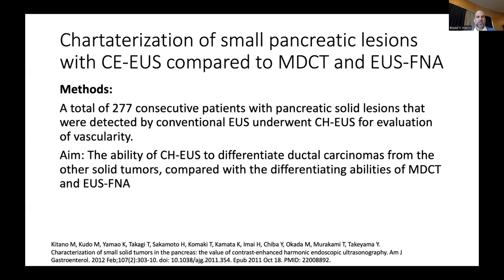The aim of the study was to compare contrast-enhanced EUS to other modalities, CT and EUS FNA, to differentiate ductal carcinomas from other solid tumors.